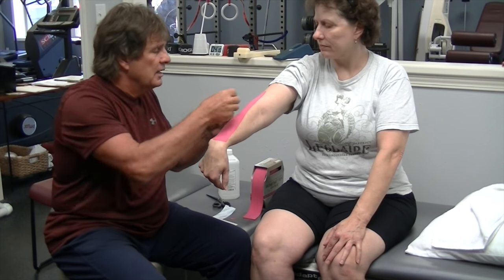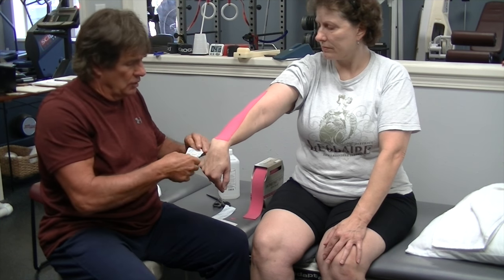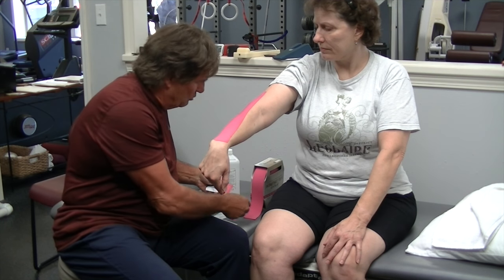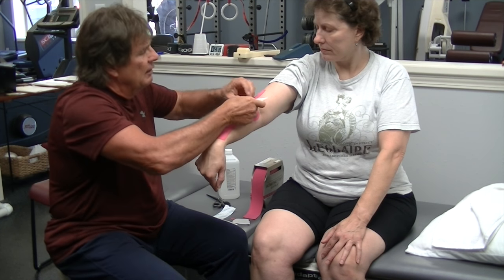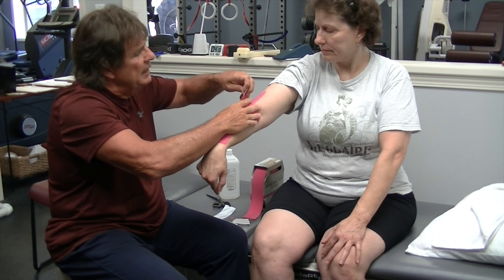And then the second piece is going to go across here where the pain area is. So I'm going to take this piece and put just a little bit of a stretch on it, right in the center over where she'd be complaining of having the most pain.